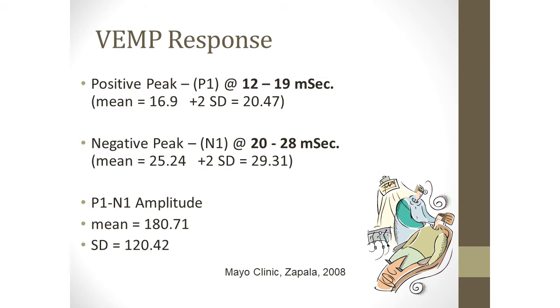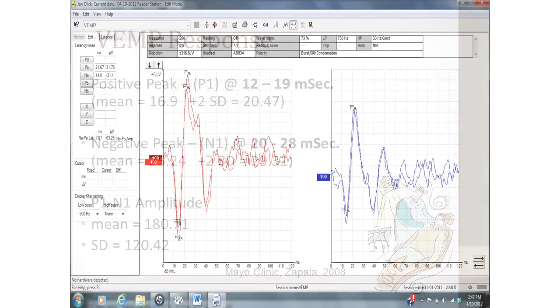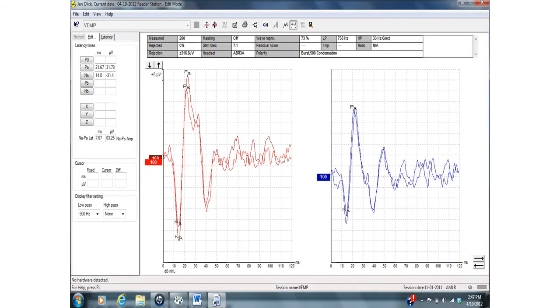And you would think if you looked at it at first that you had superior canal dehiscence on that side, but the other side was the same, you would always have an asymmetry in abnormal cases. It was just that she had such a prominent sternocleidomastoid muscle. Anyway, that was interesting. So it's going to look like this.